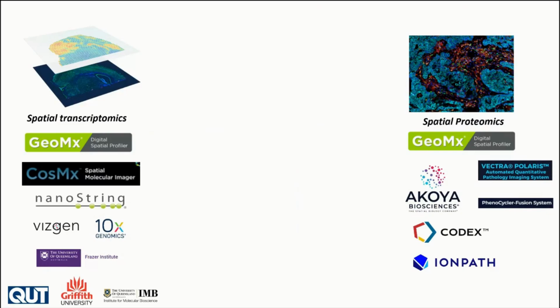So I'd love to show this slide because spatial takes a village. That's your takeaway from this. And we initially did upfront spatial transcriptomics, traditional, discovery, unbiased whole transcriptome. And then we'd go in and validate using spatial proteomics using multiple different platforms, as shown here. But what we found over the last year or so is that as the plex has increased on the protein end, that has become more discovery for us.